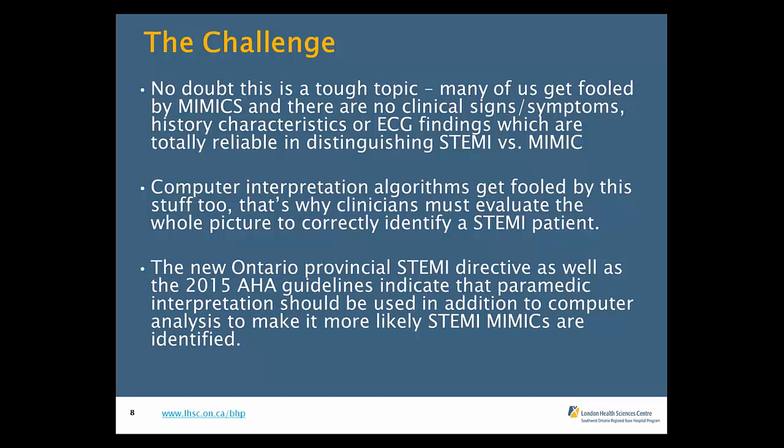If you read the January issue of the newsletter, Dr. Bradford did an article about introducing the concept of an independent double check for ECG reading. So I think we're used to it in the concept of medication safety, verifying what you're seeing, what you're giving, what you're doing with your partner. But I don't think that's something that we often bring into evaluating ECGs.